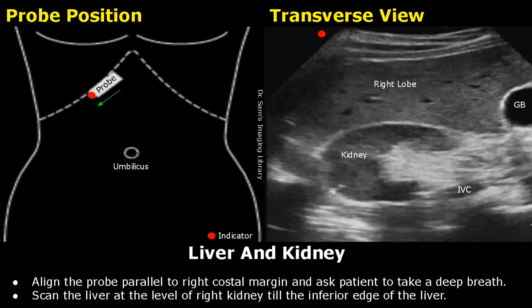After another breath hold, move inferiorly along the costal margin while keeping the probe parallel to the costal margin with slight angling towards the patient's right shoulder. You can scan the right lobe in transverse view and you will also see the right kidney. This hyperechoic structure is the renal sinus fat. This is the gallbladder. And this small anechoic structure is the IVC. There are some differences in individuals regarding actual locations of these organs, so probe positioning and protocols may be a bit different in different patients.